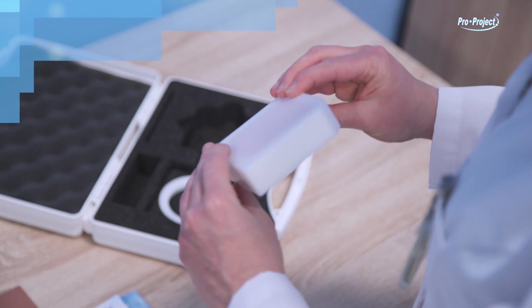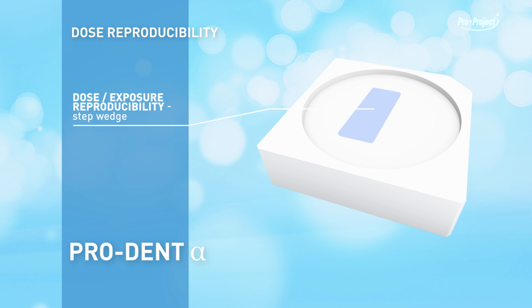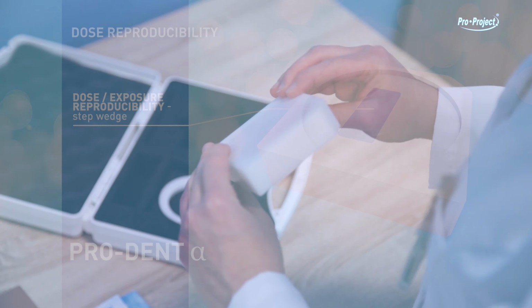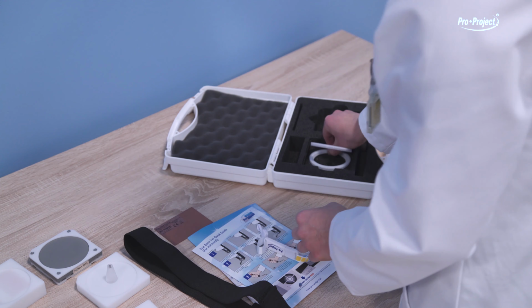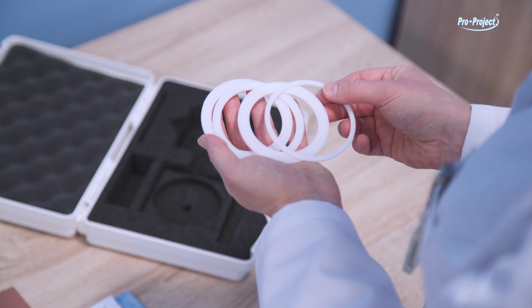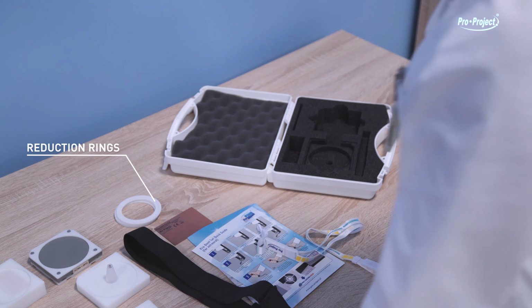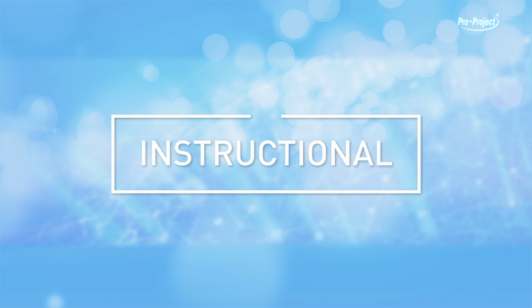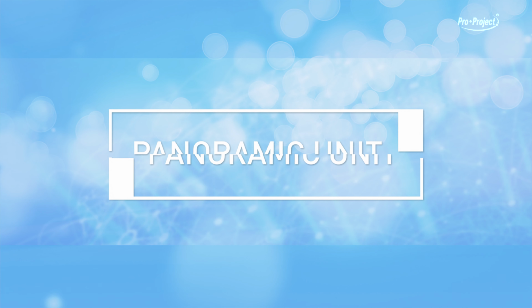Pro-Dent Alpha. Dose reproducibility. Dose exposure reproducibility step wedge. Reduction rings. Panoramic unit.